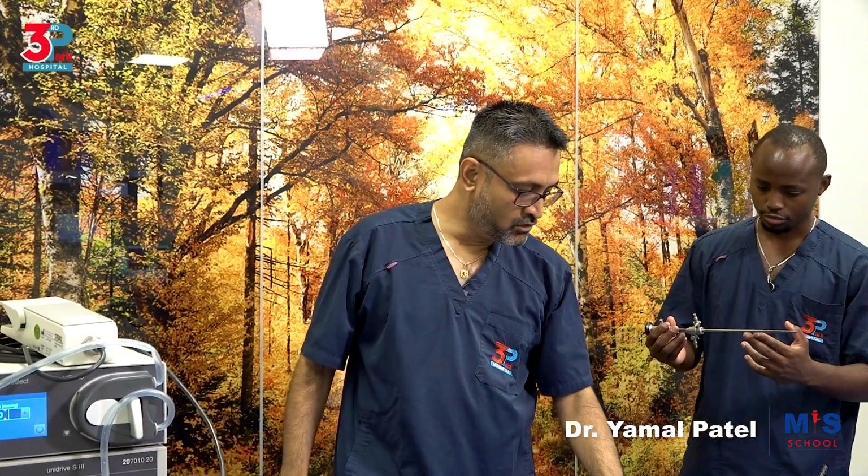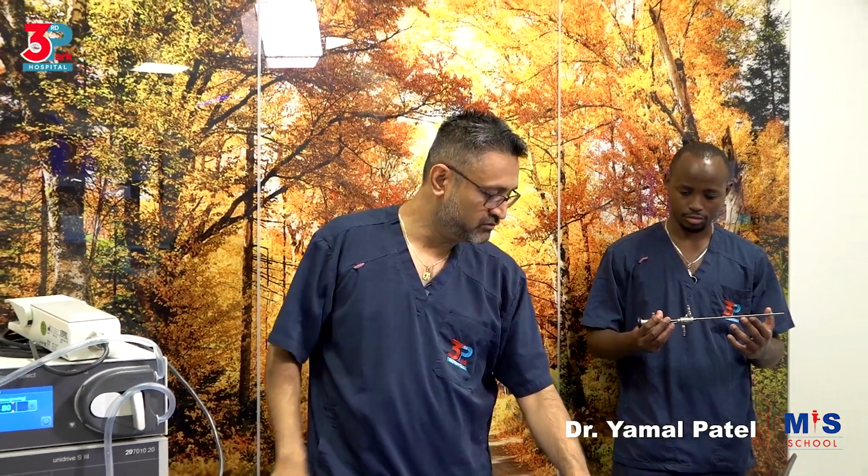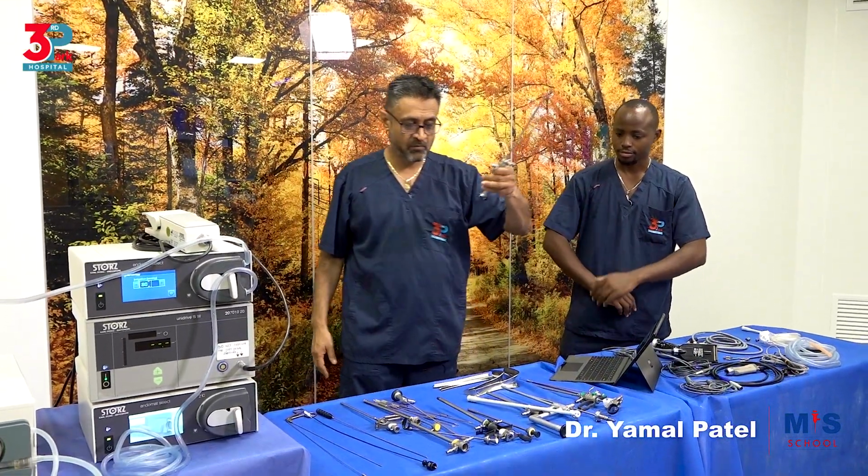If that happens, it will always pull in the fluid and the pathology towards your camera, towards your scope. So you will not be seeing anything. It will always be obstructed by the tissue in front. So what you want is to push fluid in to distend the uterine cavity and take the fluid out from the sides, from the fenestrations. So you can't interchange the in and out. Please remember that. You want a good view and therefore a less resistance flow, and that is the way to get the view correct. So this is the hysteroscope.